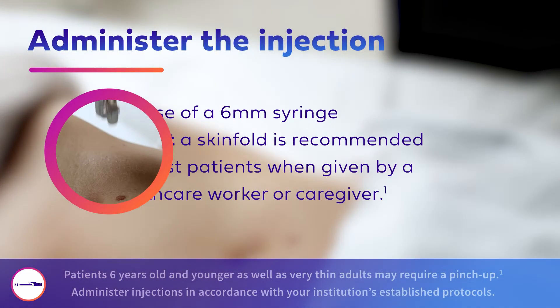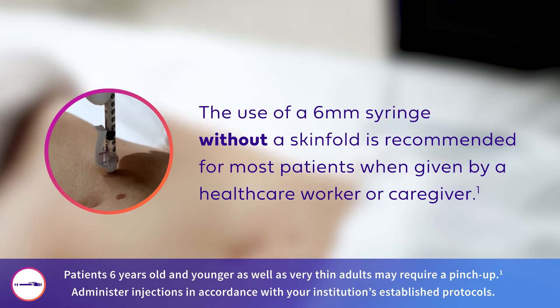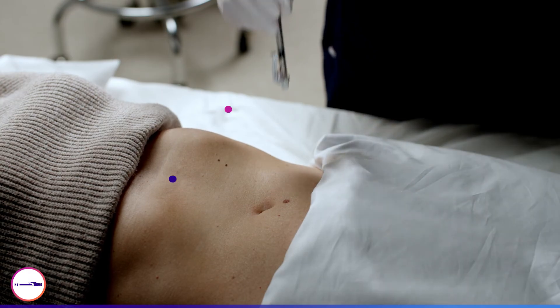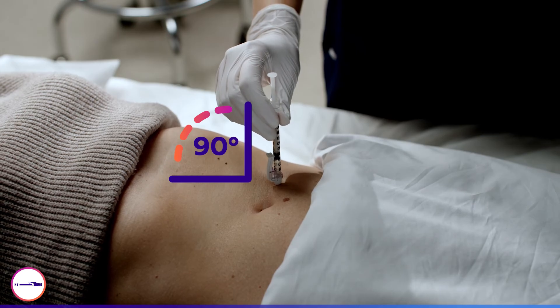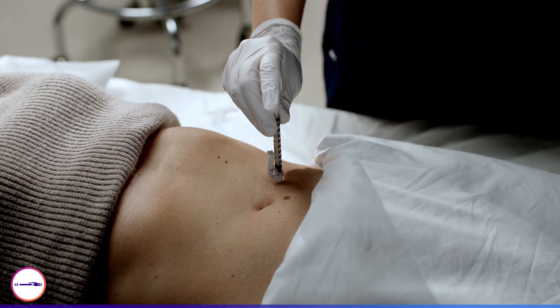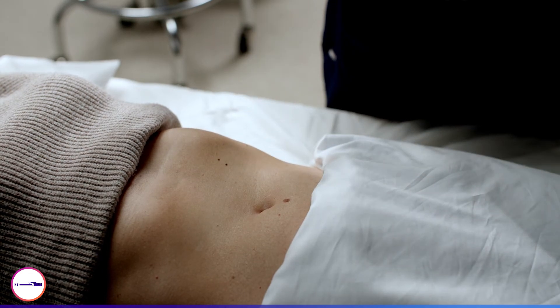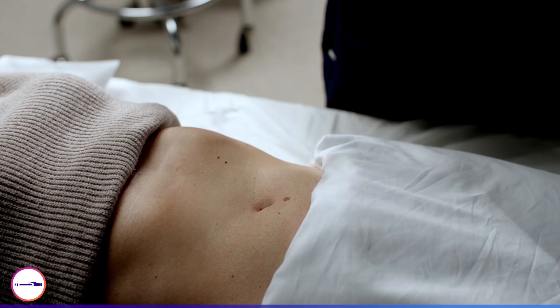To minimize the risk of needle stick injury, the use of a 6mm needle without a skin fold is recommended for most patients when given by a healthcare worker or caregiver. Insert the needle into the skin at a 90 degree angle. Press the plunger slowly and steadily until the insulin is fully injected. Once injection is complete, withdraw the needle from the skin while maintaining a 90 degree angle.